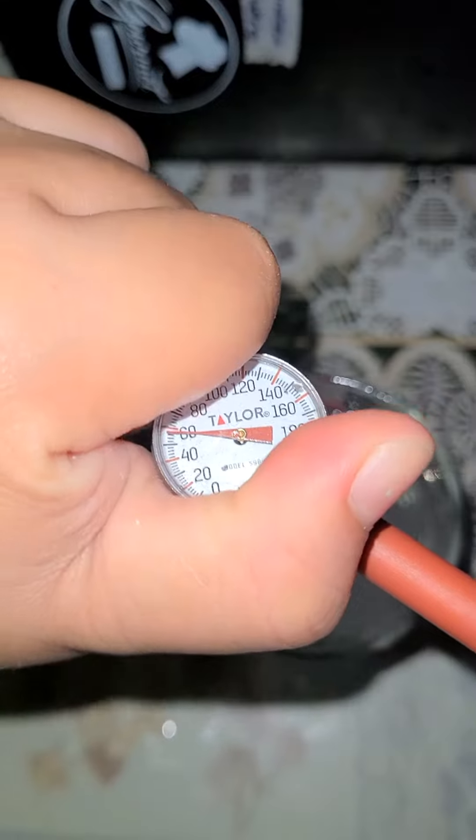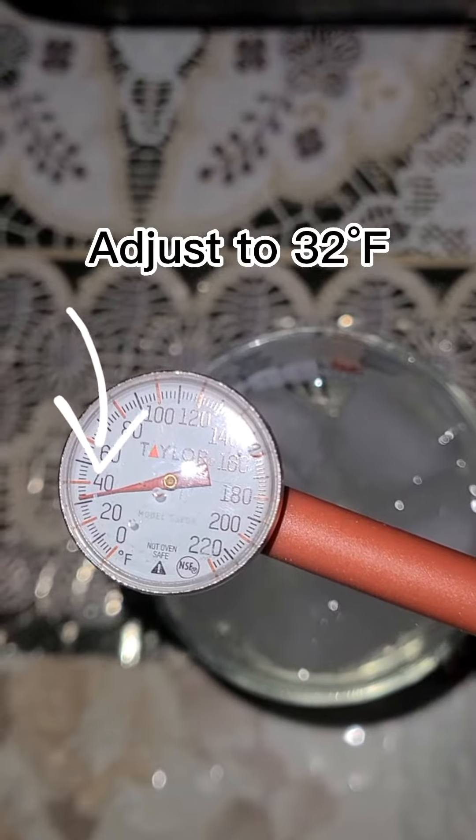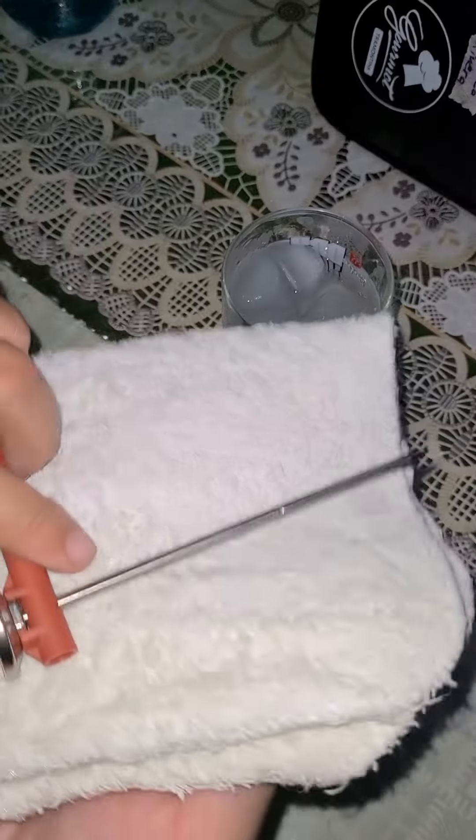After the arrow stops moving, without getting the thermometer out of the glass, gently twist the thermometer and set it to 32 degrees Fahrenheit, which is the temperature of iced water.